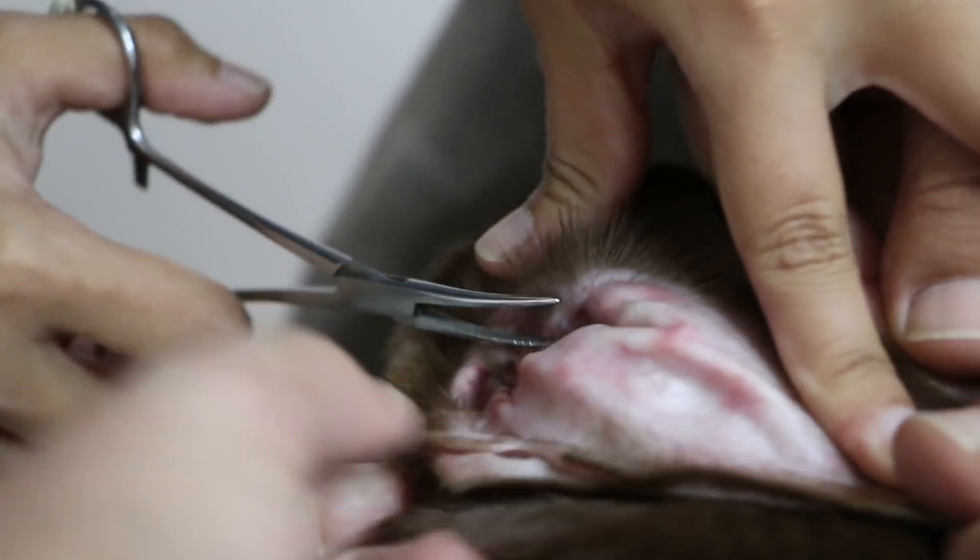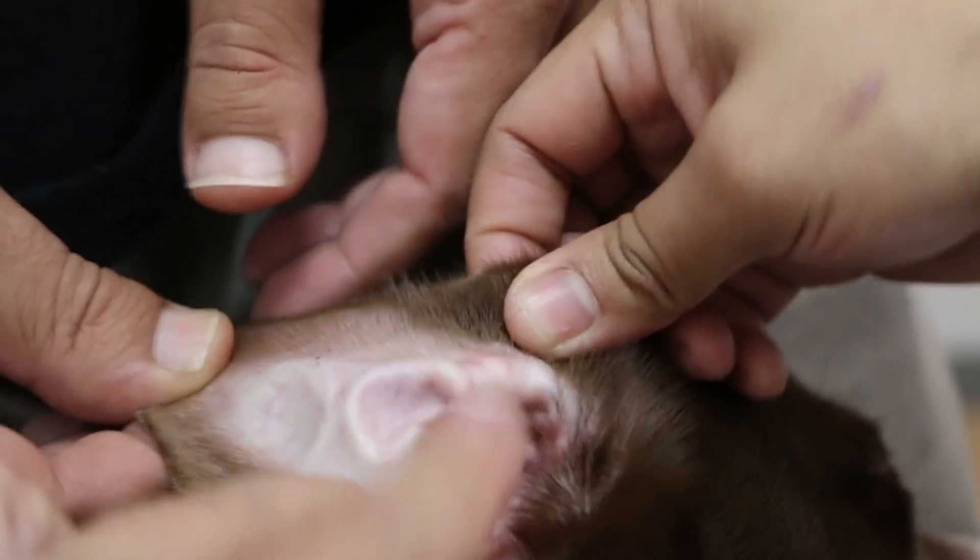Now the ear one is bad. Really get the hair — get the hair from this one. Then the other ear as well, so that you don't miss it. Get one more near to it, the lower part there.